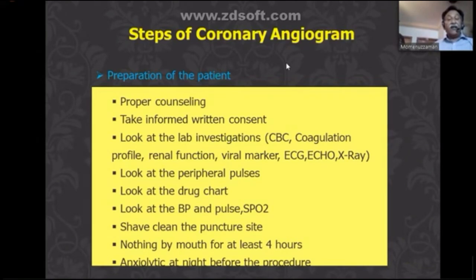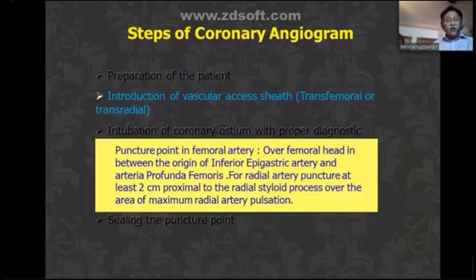There should be a clean shaving at the puncture site. The patient usually has been fasting for at least 4 hours, because some dyes sometimes cause vomiting, and that may lead to aspiration. To avoid these things, you need to advise the patient about fasting. Some patients are a little bit anxious, so they may need some tranquilizer. Next step is the puncture site. As I said, the puncture site is commonly the radial, but you should also know the femoral.